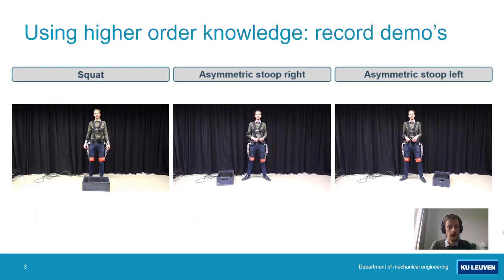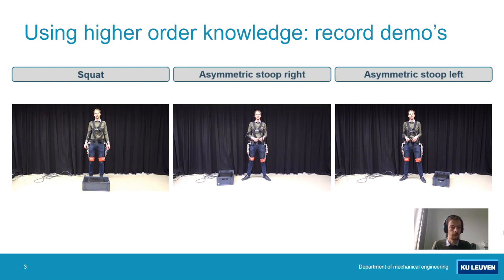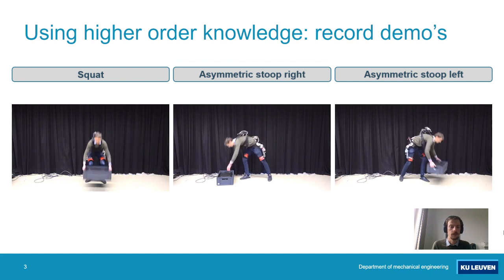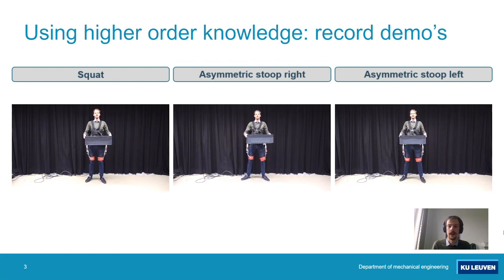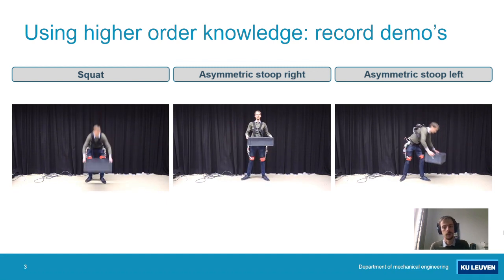To be able to use higher-order knowledge about the motions being executed, the exoskeleton needs to have access to a database of known motions. To create this database, I recorded myself while performing different types of motions, using the sensors on the exoskeleton to record myself. I performed squat motions, asymmetric stoop left motions, and asymmetric stoop right motions.